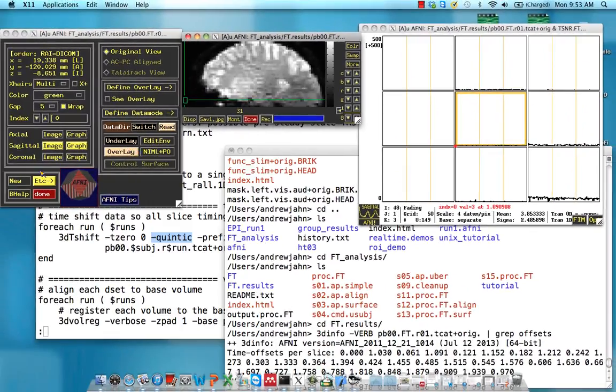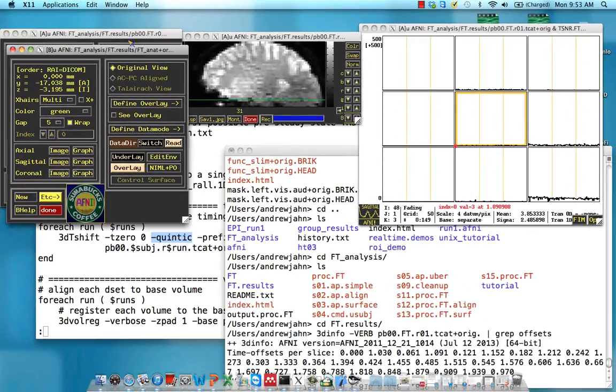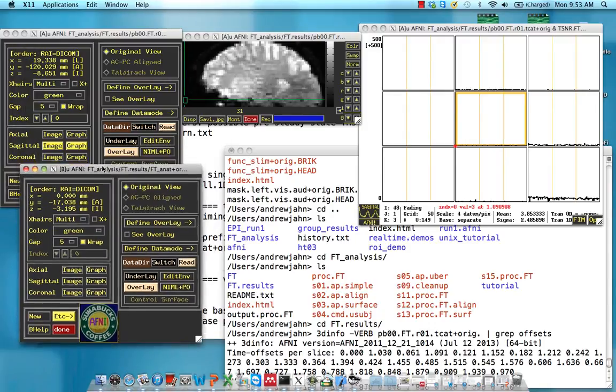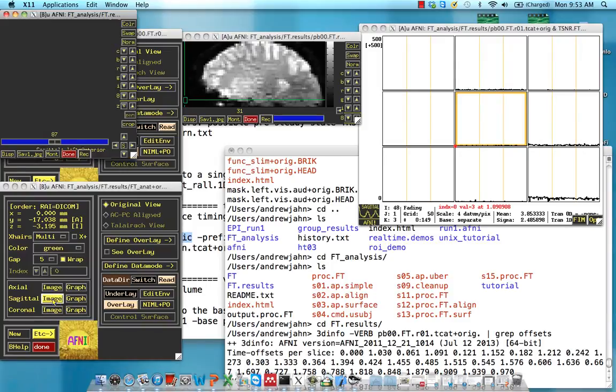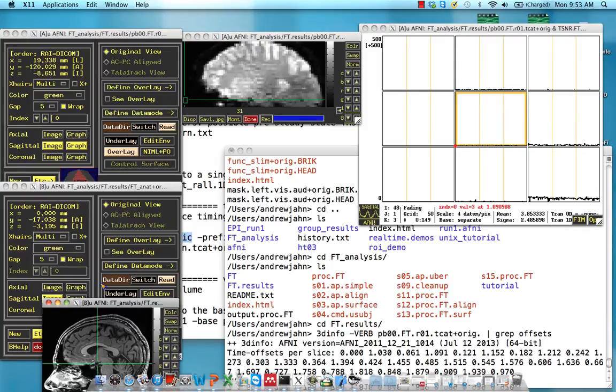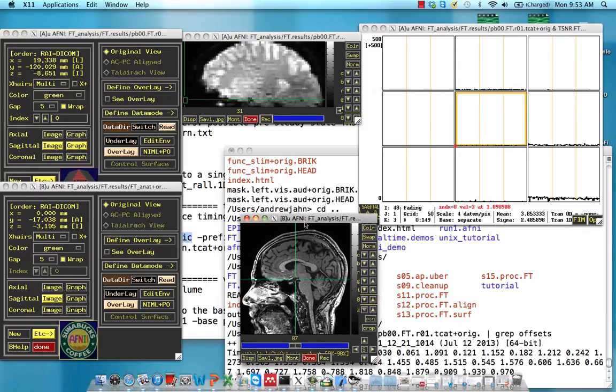Let's compare this to our slice time corrected dataset. So I open up a new AFNI viewer. Open up sagittal.